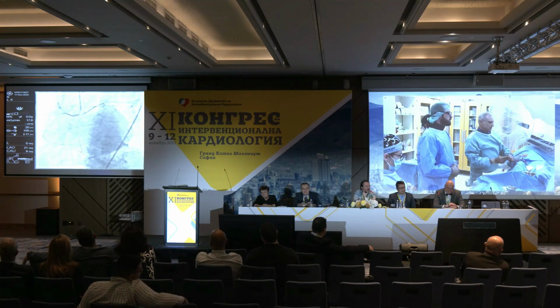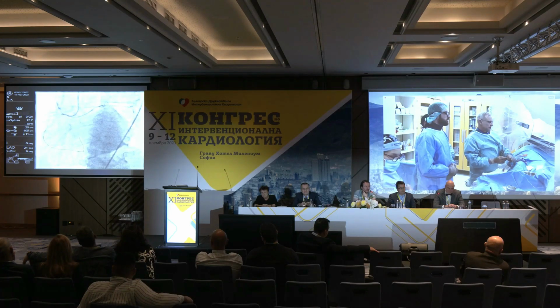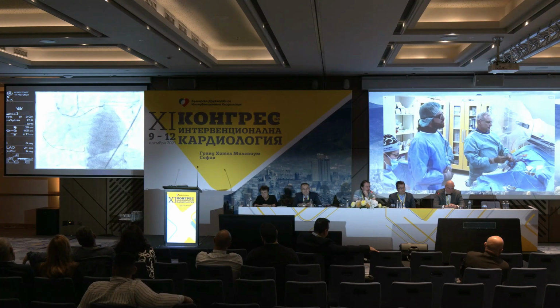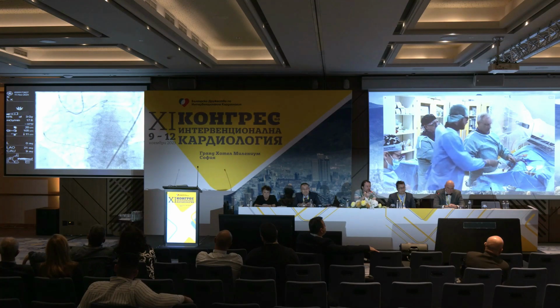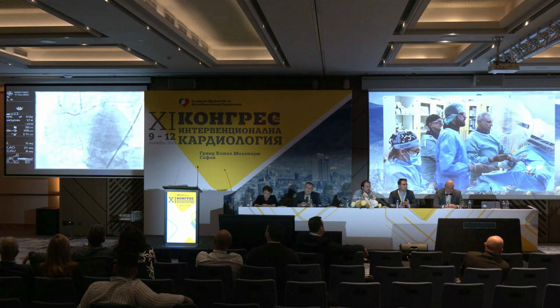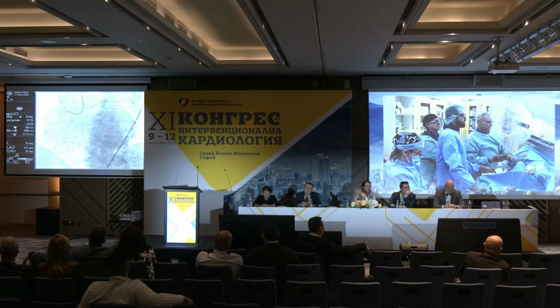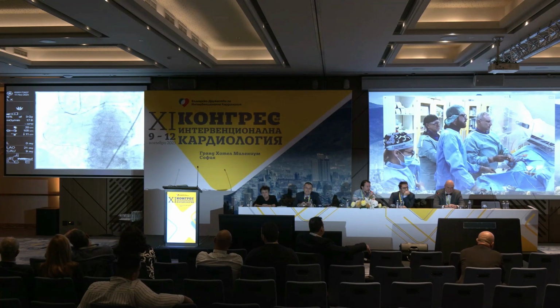Nothing is easy here. Yeah, I know, but that's the reason why you should knuckle somehow from somewhere, and the easiest part is now knuckling from antegrade. And you cannot do it retrogradely because you don't have good support, and you cannot puncture the cap there. But antegradely, you have the opportunity, I think, at least going a little bit into the proximal cap with your microcatheter, and then try to knuckle down with a soft wire. Then you know the course of the artery. I know it's not easy. I know that, of course, but you don't have good support there.